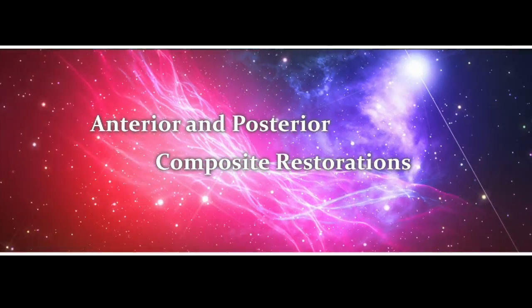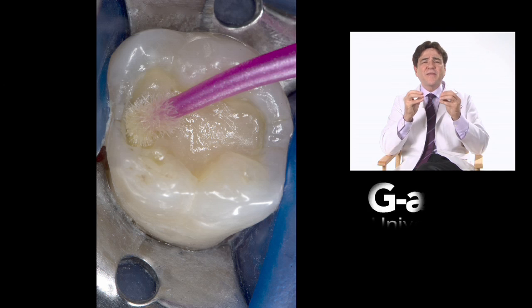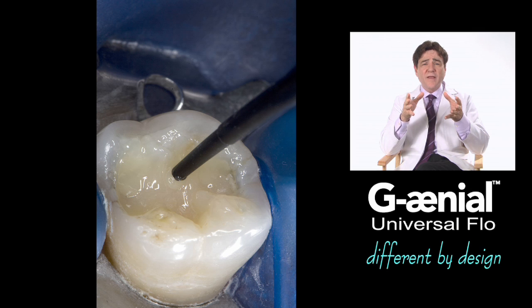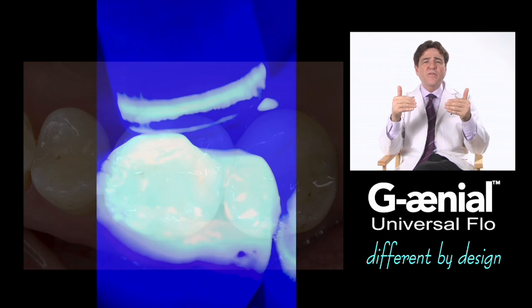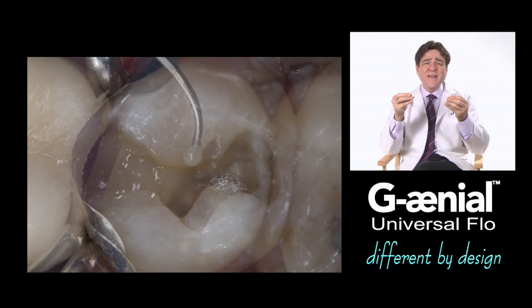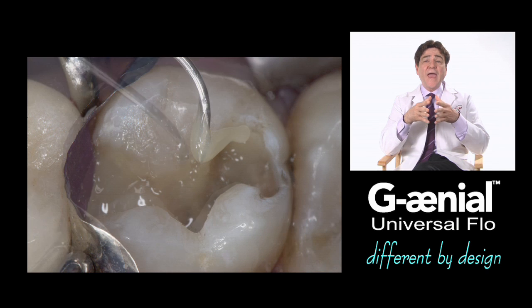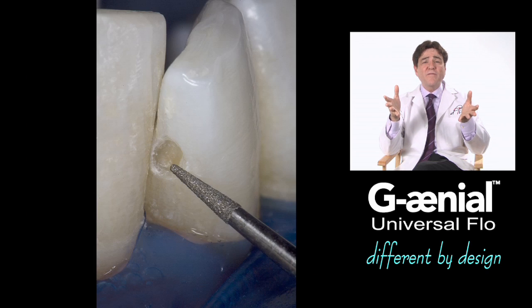For anterior and posterior composite restorations, by utilizing precise restorative placement techniques, conservative adhesive preparation designs, and a more thorough adhesive protocol, these advanced formulations such as G-aenial universal flow can be utilized for Class 1, Class 2, Class 3, Class 4, and Class 5 restorations, diastemic closures, and direct veneers.